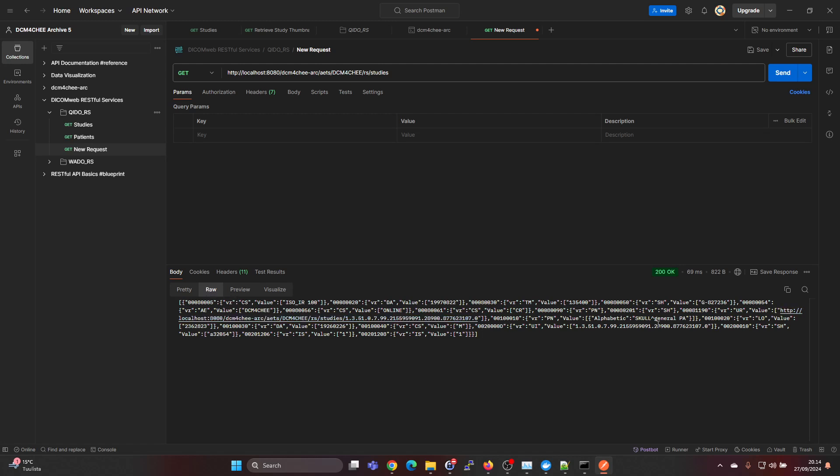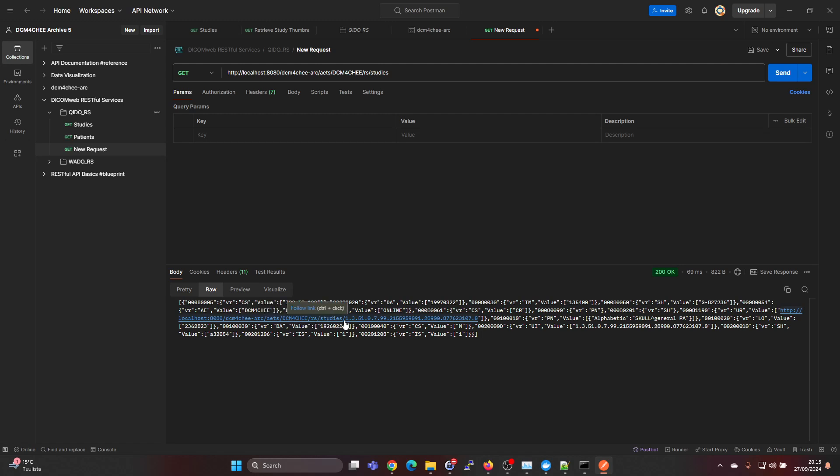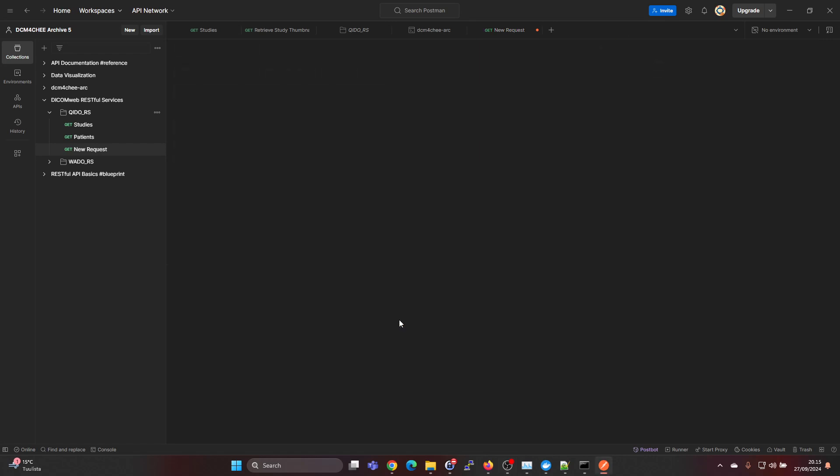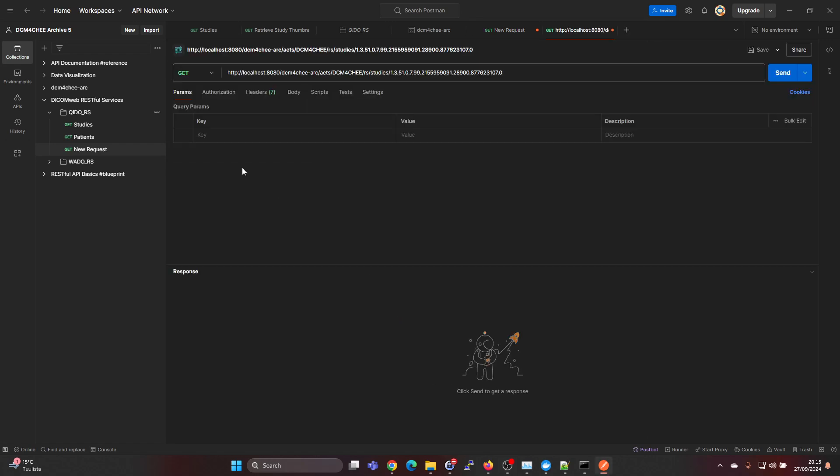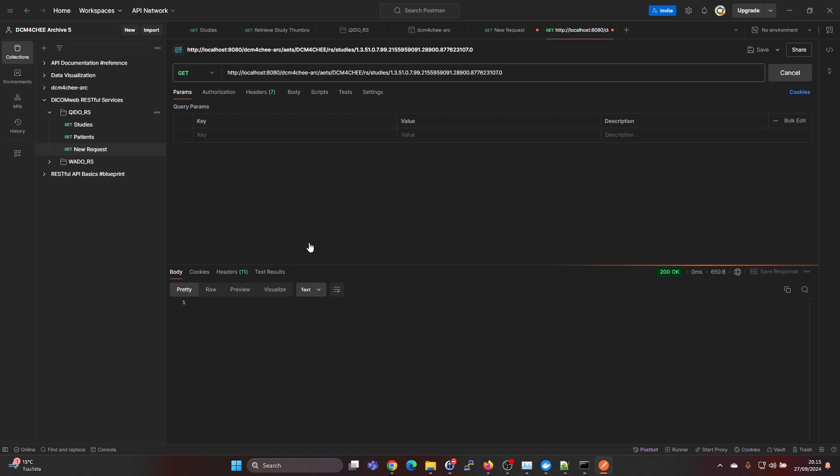Here we can see that it actually provides a URL for doing a studies query for the specific study. We can click here and it will generate us a new request, and we can query like this as well.